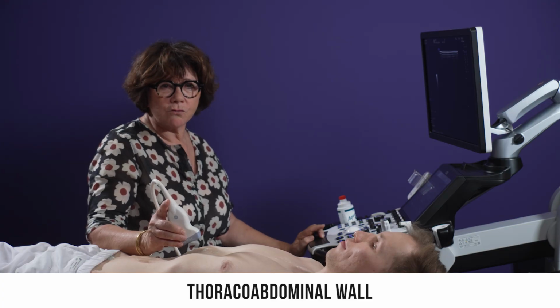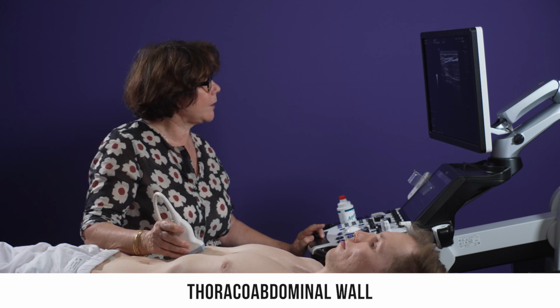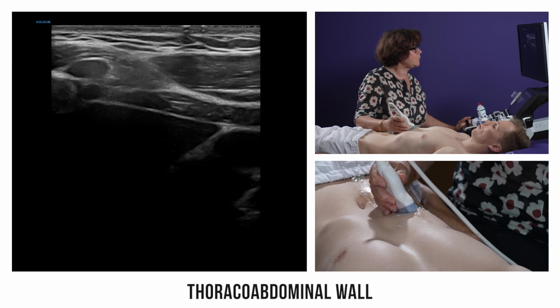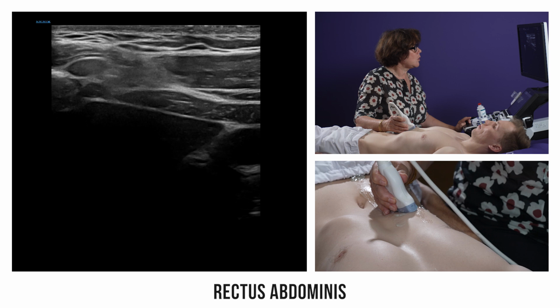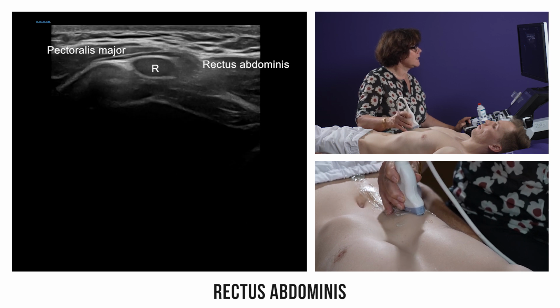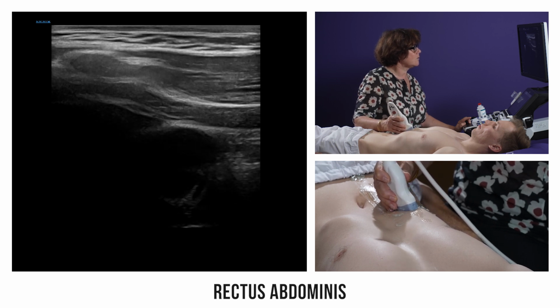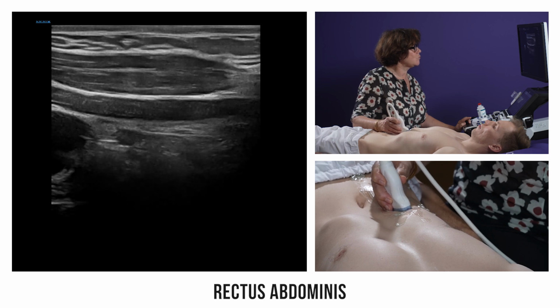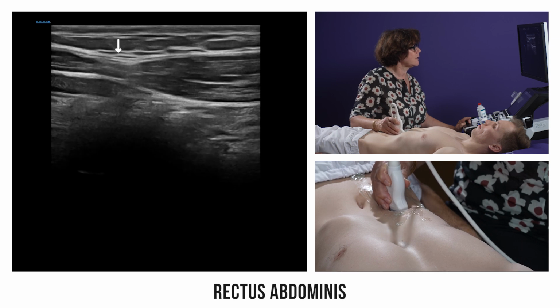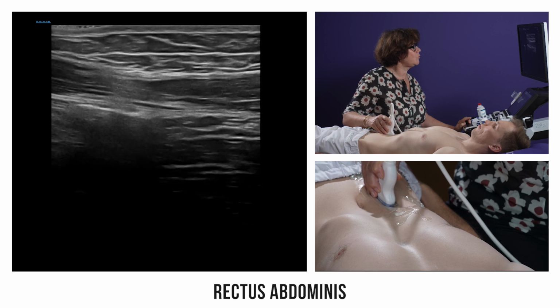Now let's examine the muscles of the anterior abdominal wall on ultrasound. We begin with the paramedian sagittal view of the upper abdomen. Here we can see the insertion of the rectus abdominis blending with the inner fibers of the pectoralis major. Moving the probe downward, we follow the long muscle body with its fibrous bands separating the different segments. Another fibrous band extends down to the pubis.